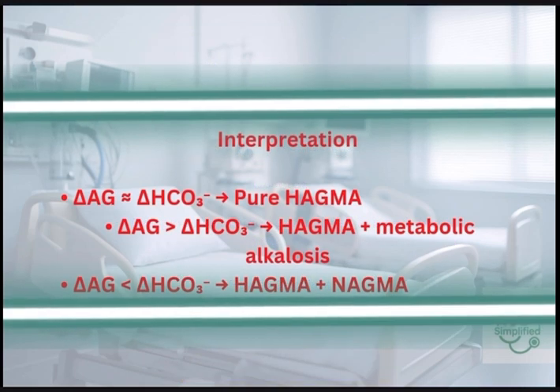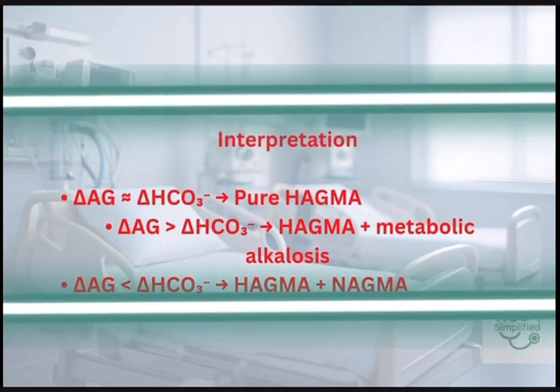Now that we have validated the ABG and understood the underlying principles, we can move on to interpretation. From this point onward, we will apply the same stepwise approach every time, starting with the pH, identifying the primary disorder, checking compensation, and then looking for mixed acid-base abnormalities when needed. The key is to stay systematic and avoid jumping to conclusions. When you follow the steps in order, ABG interpretation becomes logical and predictable.